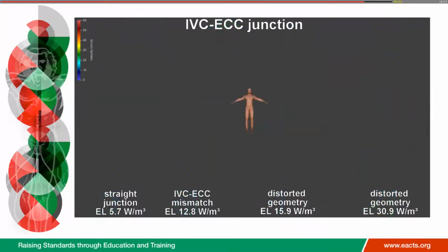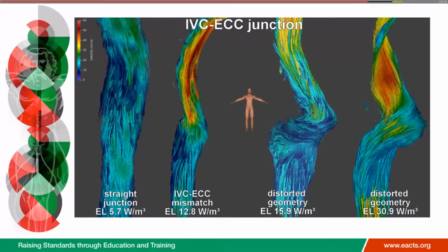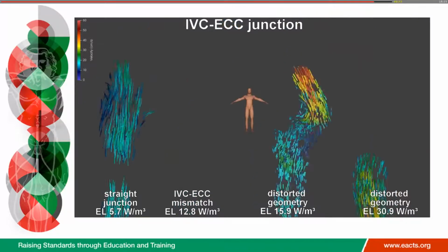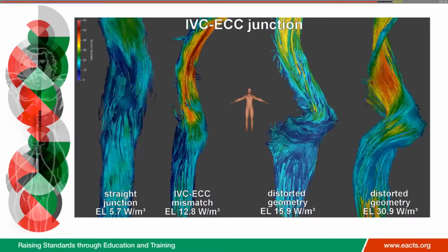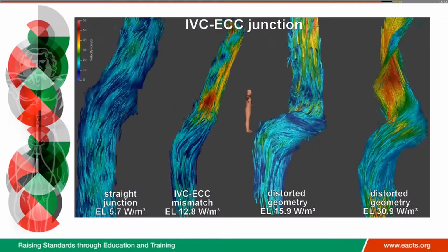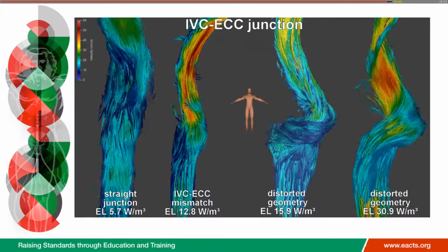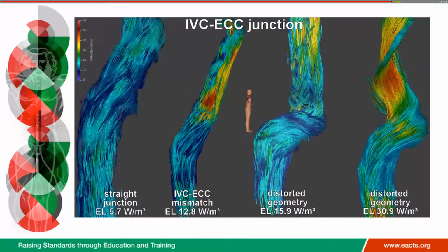Nice data. Quick question. The first graph there almost looks like a lateral tunnel. It's a straight shot up there, but obviously it's an extracardiac conduit. When it comes to the technique of how this is done, did you find any correlation in those patients where the IVC-RA junction was completely amputated and then the graft was sewn in, versus, I know in some centers, they leave some of the IVC attached to the right atrium, and therefore the extracardiac conduit comes in lateral and makes a loop to go up? Did you actually have any of that data?